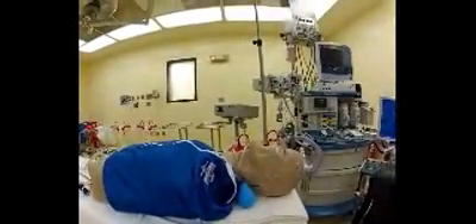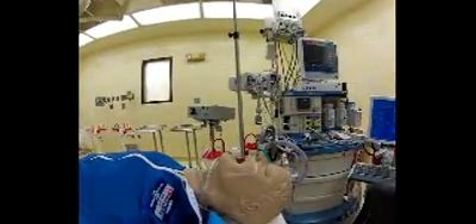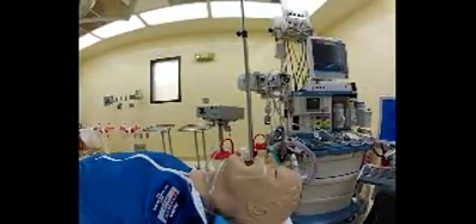and I've actually even used them with ventilating rigid bronchoscopes. What we're going to do here is give a demonstration on a mannequin of face mask ventilation, supraglottic airway ventilation, and tracheal tube ventilation.